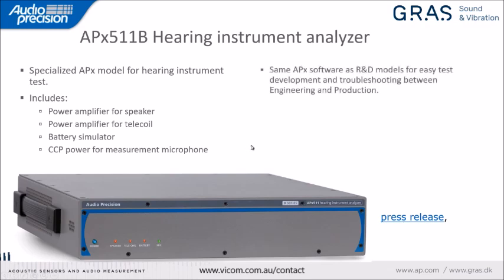Now, this uses the same APx software as our audio analyzers, used for R&D. And this allows for easy test development and troubleshooting between engineering and production. It has fast measurements, high performance, and very flexible software.